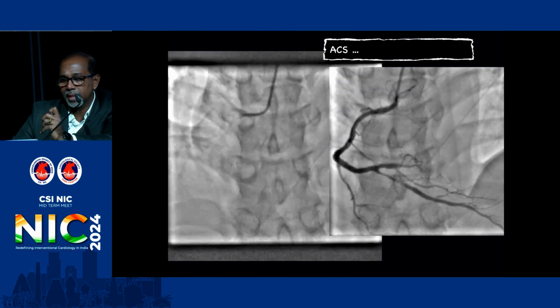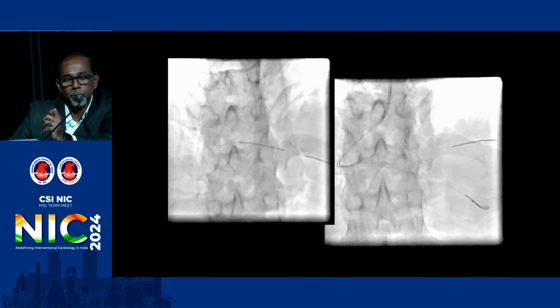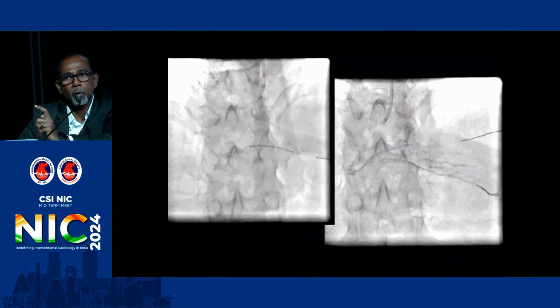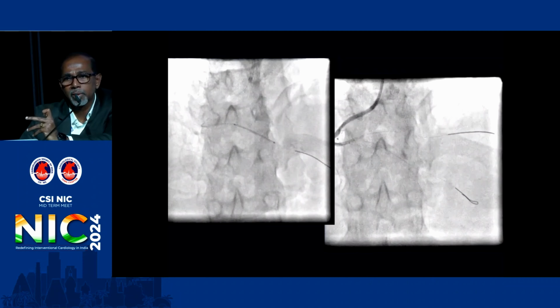This is a patient who had a PDA tight stenosis. We went ahead with stent implantation of PDA. However, following the stent implantation, we missed the ostium. 2-3 millimeters of the ostium was missed. So we were debating whether we should be putting another stent at the ostium of the PDA or not.